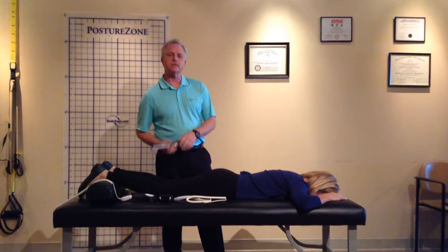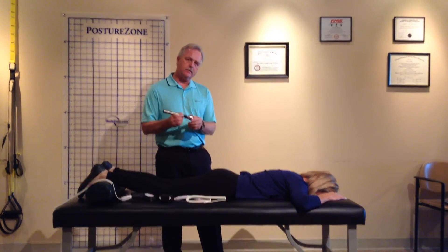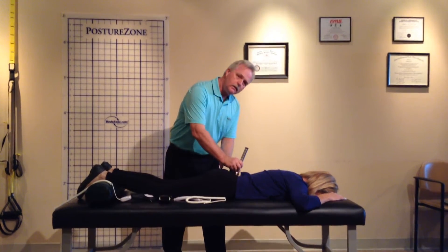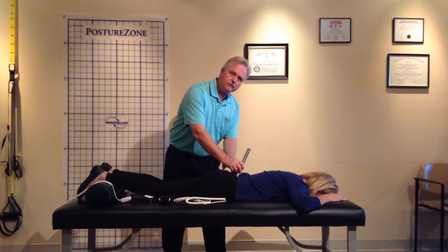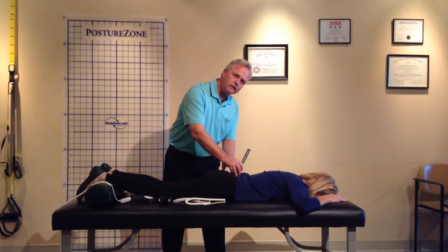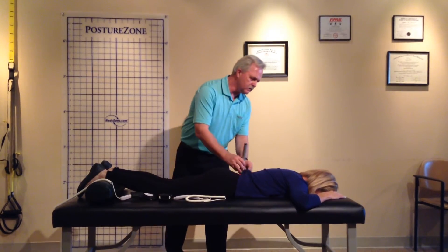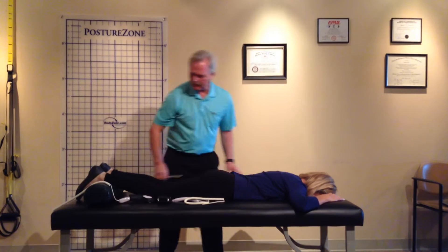We'll start out with the old laser — I'll show you a little bit about it. It has a battery that screws on the back of the unit. It has three heads, and you can treat any area. There are 33 seconds per time you push the button, and so that's one cycle. You can treat any of these areas — it's a beautiful way to enhance your treatment.